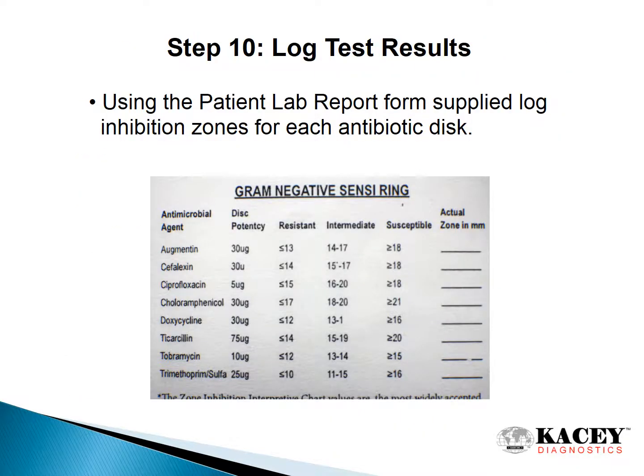Step 10. Log test results. Using the patient lab report form supplied, log inhibition zones for each antibiotic disc.